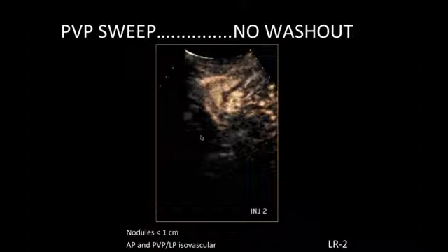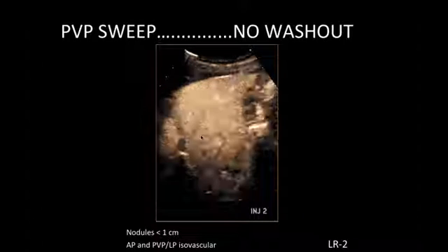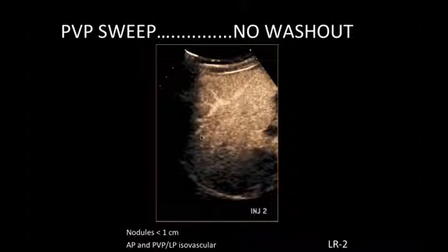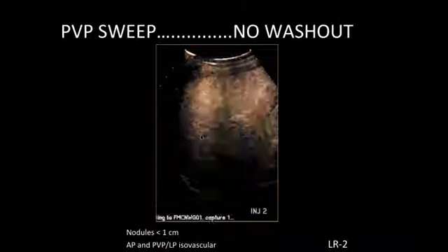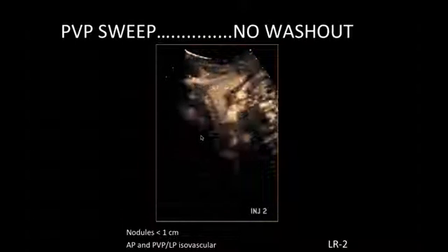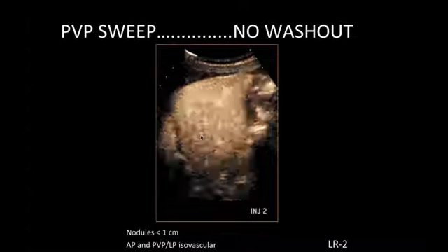The contrast-enhanced ultrasound criteria for looking at soft tissue in the vein is that when we're looking for enhancement, we must time the enhancement so that we are certain that any enhancement that we observe is in fact correlating with the arterial phase. And it must correspond on dual screen imaging with the mass that we've shown in the vein, and we have to look for washout in the portal venous and late phase as we do for HCC.